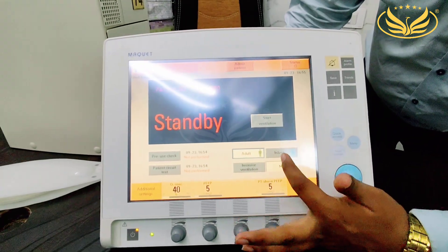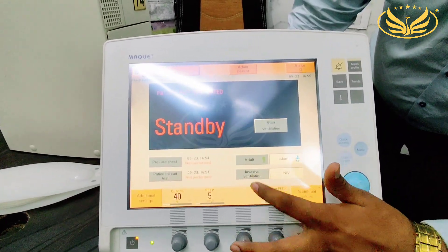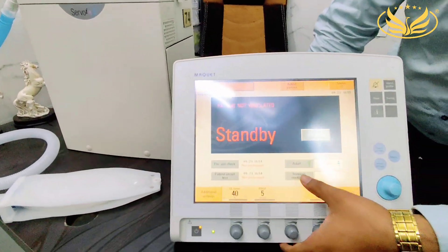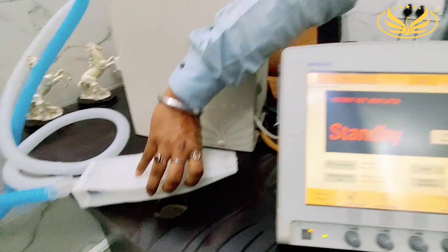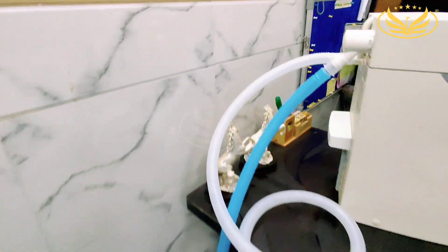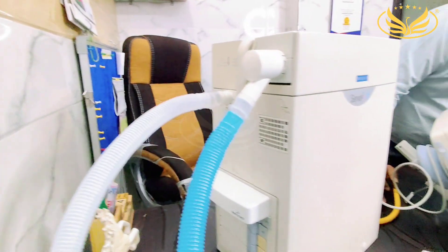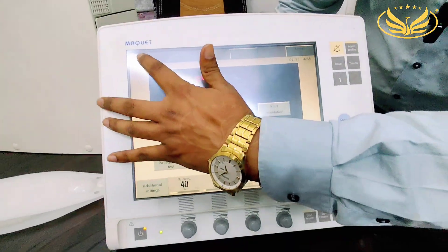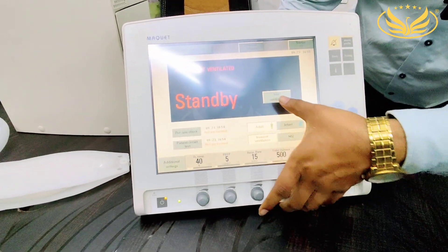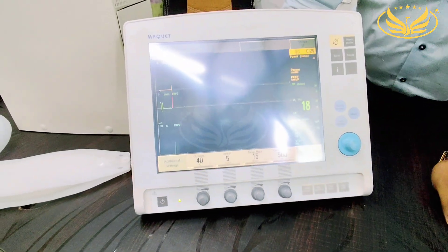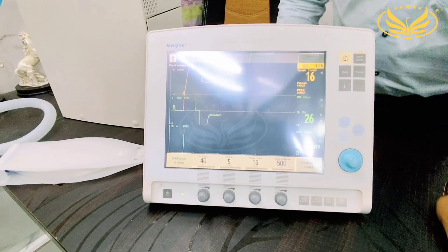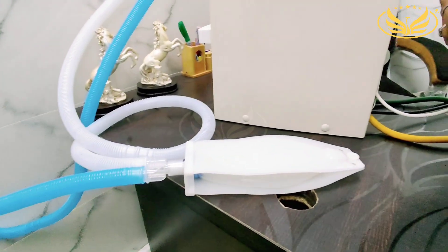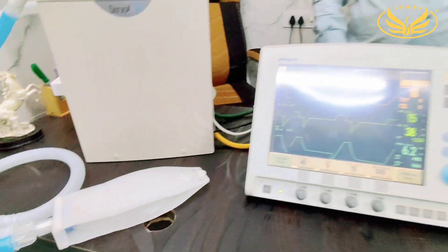Here we have adult and infant patient categories. We have connected an adult circuit and adult test lung, so we have chosen adult and invasive mode. From here we start ventilation. The moment you start ventilation, you can see the lungs receiving the pressure of air and oxygen, and the tidal volume of the ventilator is getting delivered.